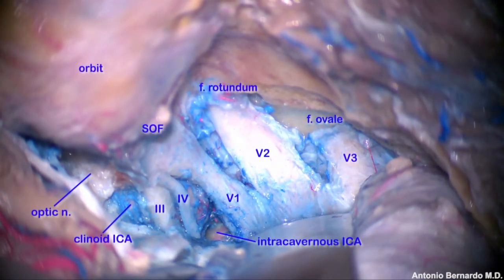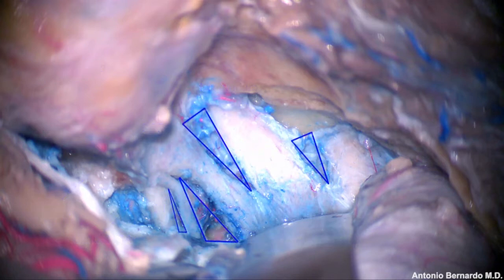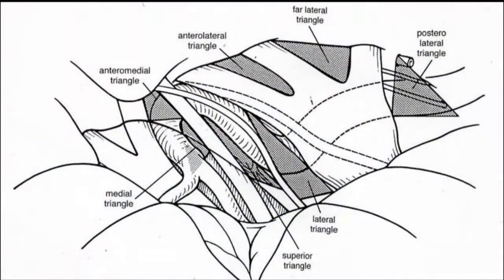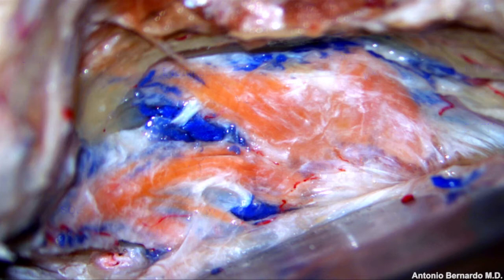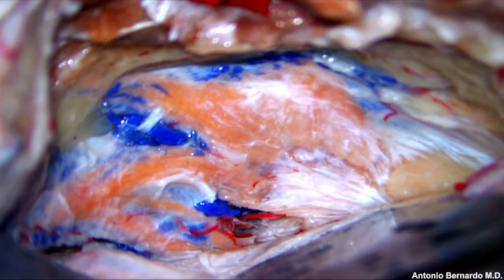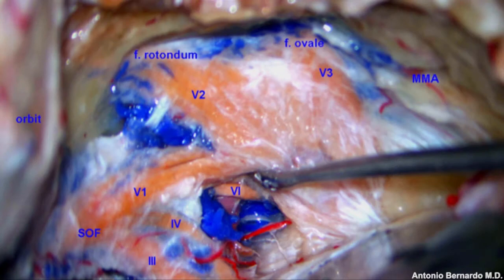The lateral wall of the cavernous sinus is completely visible, and from superior to inferior one can see the optic nerve, the paraclinoid space, the oculomotor, the trochlear, V1, V2, V3, and the gasserian ganglion. The most common triangles are the superior, the lateral, the far lateral, and the anterolateral. V1 can be followed all the way down to the superior orbital fissure, V2 to the foramen rotundum, V3 to the foramen ovale. The middle meningeal artery is cut at the foramen spinosum.